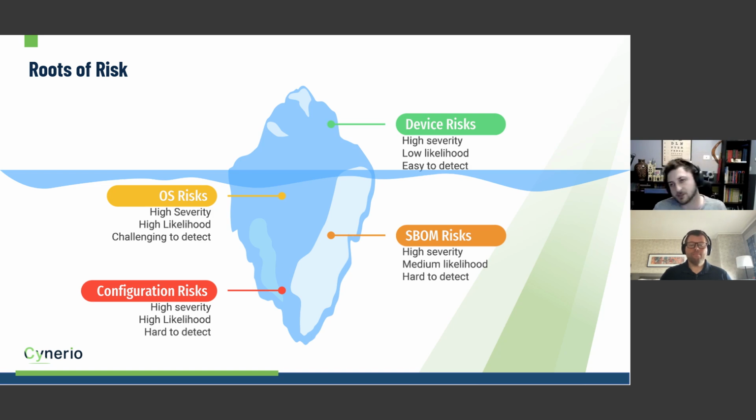The last category is maybe a little bit less well defined, more of a catch-all, but we've taken to calling this configuration risks, right? If we're looking at a CT device, it could have an outdated operating system. It could have a specific kind of log4j that is still susceptible to the Log4Shell vulnerability. It could have a device level risk.